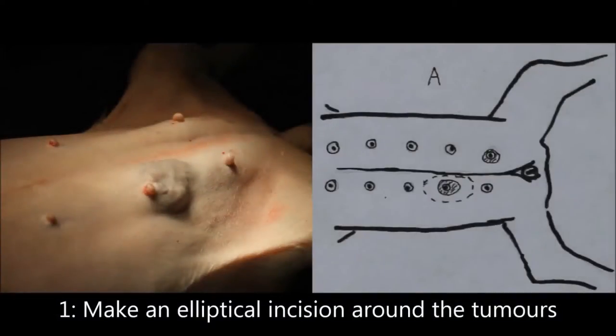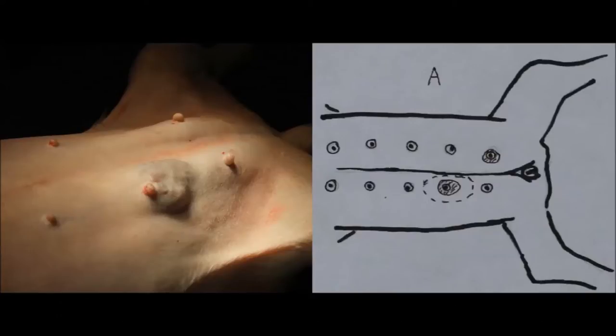Step 1 is to perform the incision of the skin and subcutaneous tissue. The incision should be a minimum of 1 cm away from the tumour to prevent recurrence of the tumour.